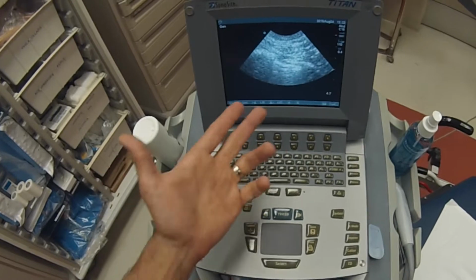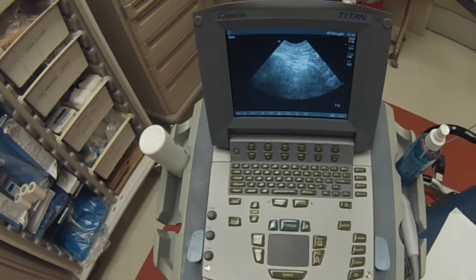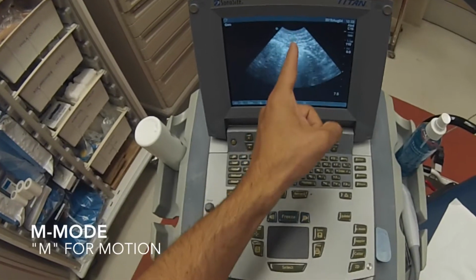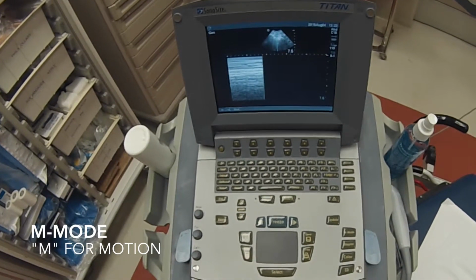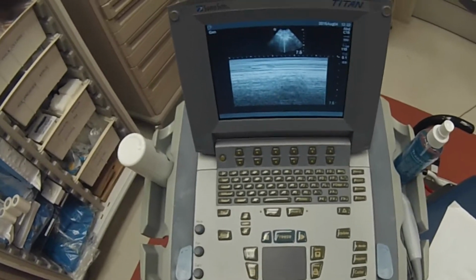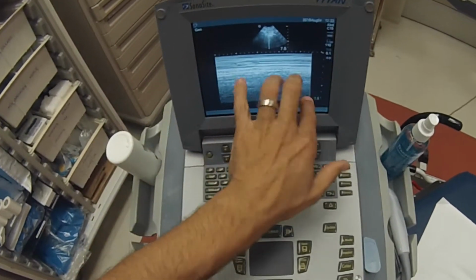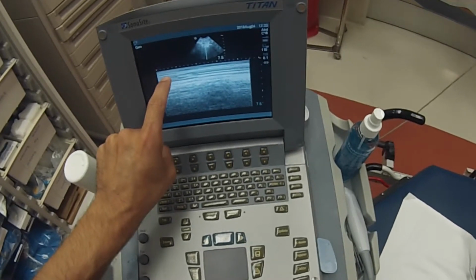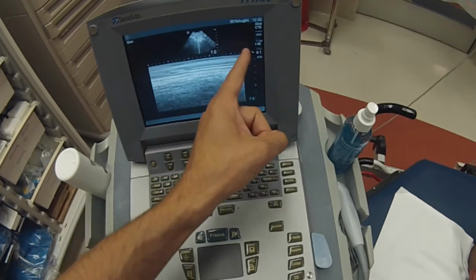In some cases you can't really see this quite well. Motion is difficult to see due to whatever's going on in the patient's chest. You can use M mode, which drops an M mode spike through the center here. Hit M mode again. Take a deep breath for us. And you might get an image that looks like this. This is called the sand and sea sign. This part being the sea looks like water, looking down from above at the beach, and this looks like sand from the beach. This is a lack of motion through the tissues of the chest, the muscle, the bone, and then this is the lung tissue that's moving, right? So there's motion there. That's why it looks all speckled when you look at it in M mode.